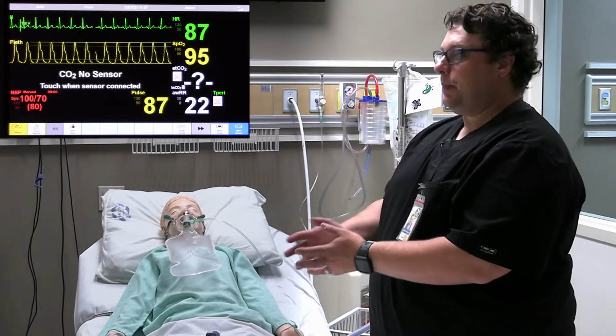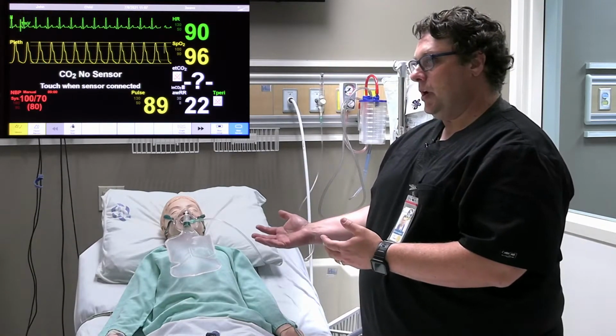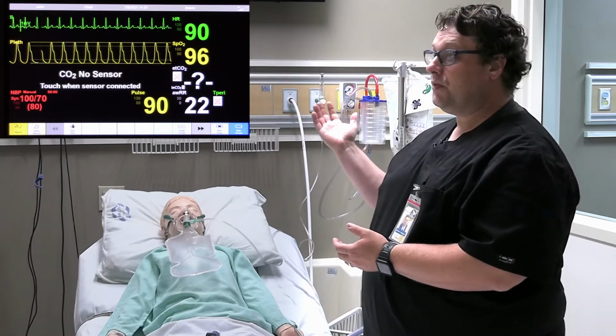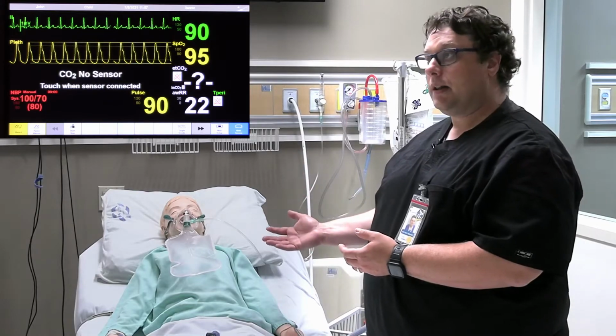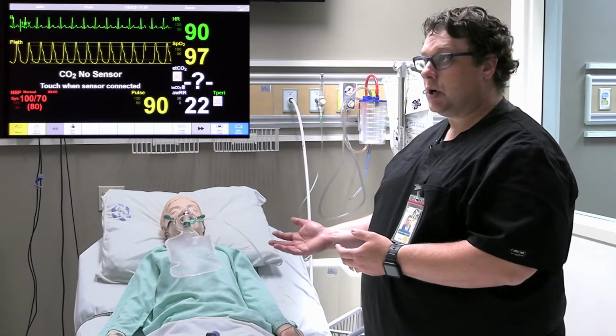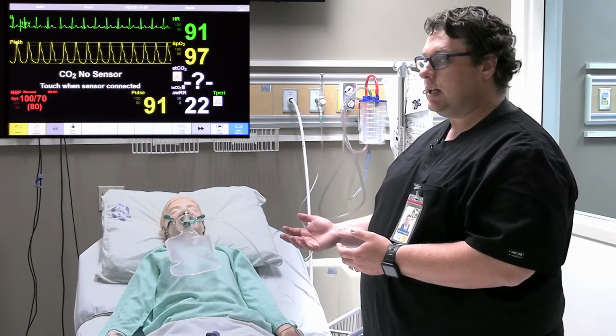Here we are back with our patient, and we're still on a non-rebreather. Their SATs have improved, and the patient's much more comfortable. But we don't want to leave the patient on the non-rebreather long term, because the gas is dry and it could be very irritating to the patient.